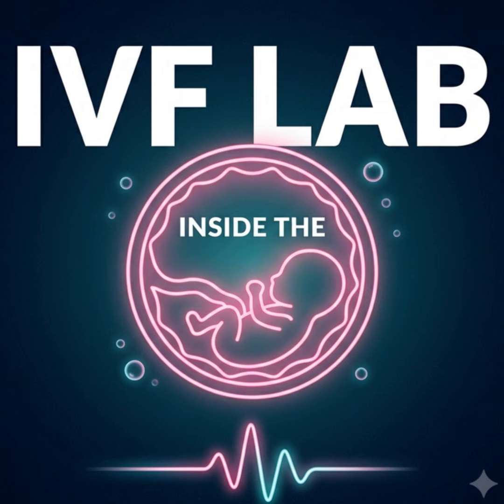Crucially, time-lapse cannot confirm chromosomal normality. We call this ploidy status. An embryo can divide with absolute metronomic morphokinetic perfection. It can look utterly flawless on day 5. It can be ranked a 9.9 out of 10 by the AI and still be genetically abnormal. Wait, really? Yes. Yeah.